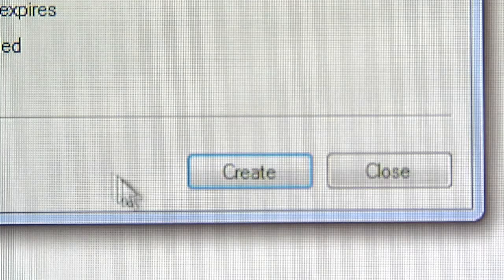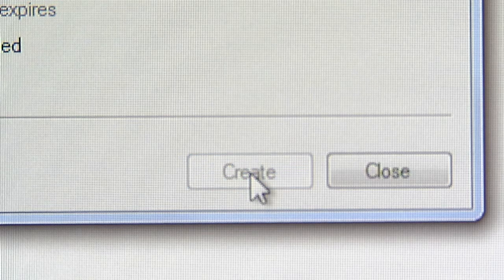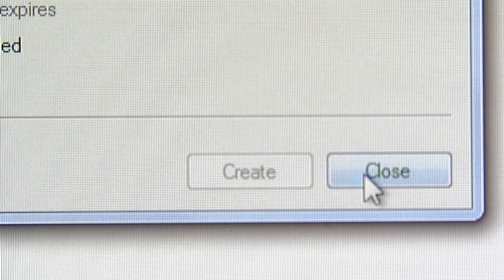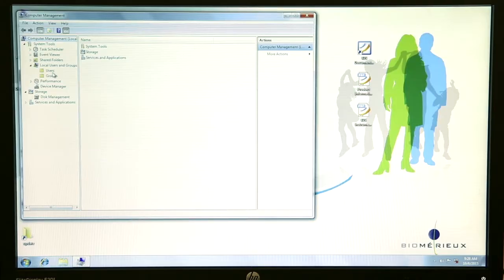Click the Create button. Repeat the process to create other new users if necessary. Click the Close button. Next, we will assign the new user to a group or groups depending on the specific functions they are required to perform.